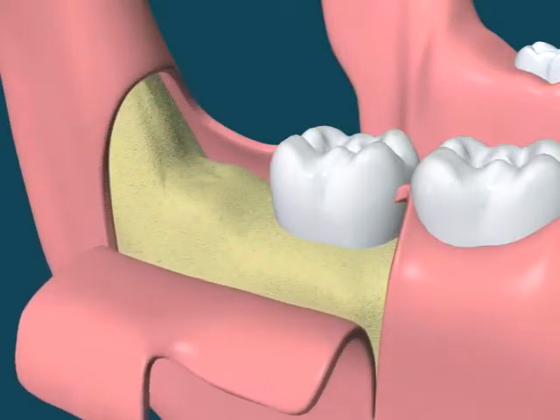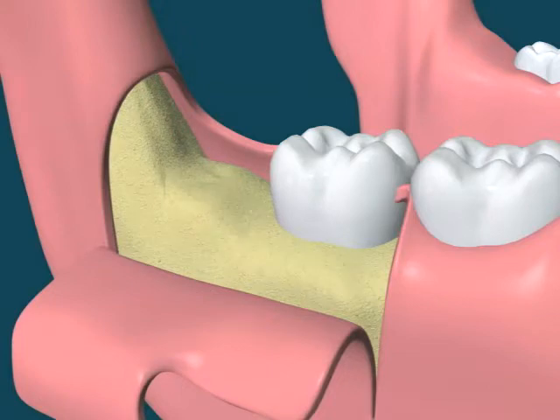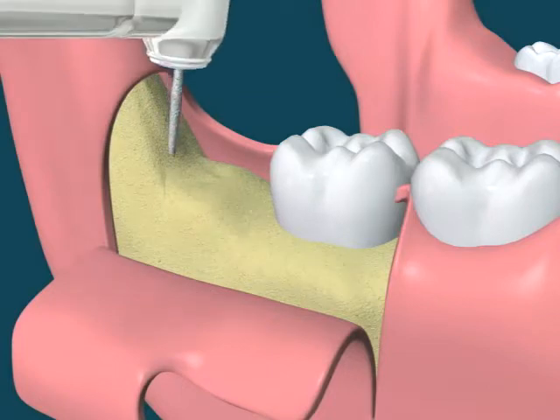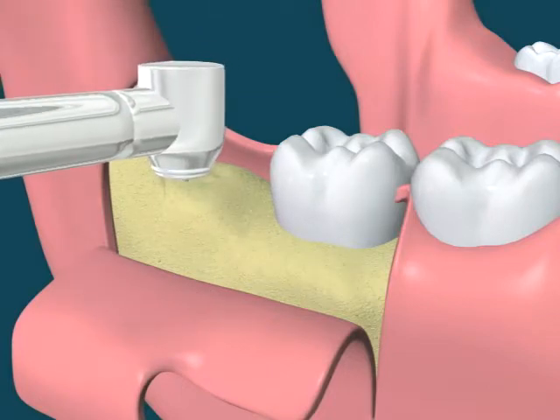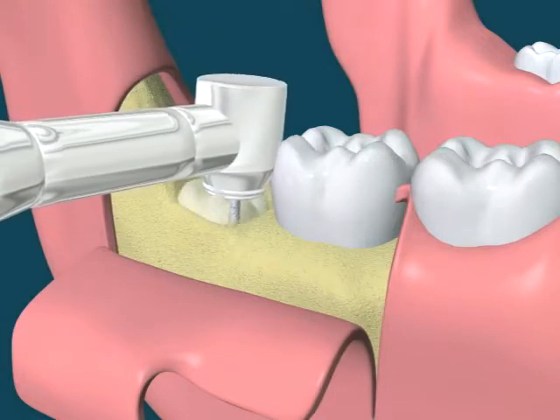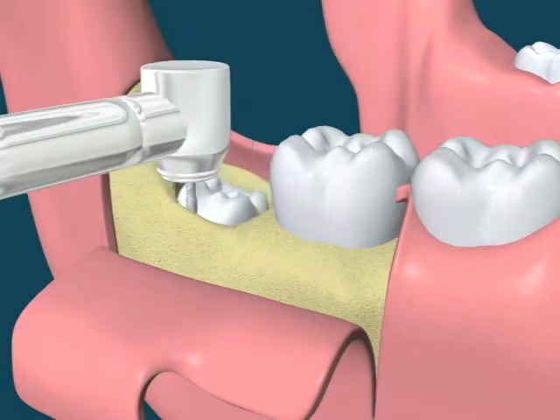Gingiva above the impacted tooth is flapped. With the help of a drill, the bone above the impacted tooth is removed to create access to the impacted tooth.